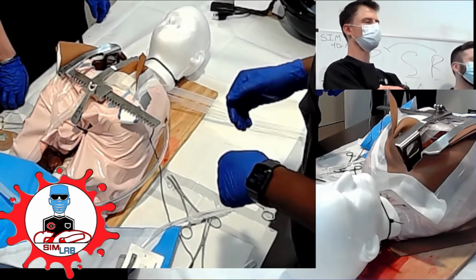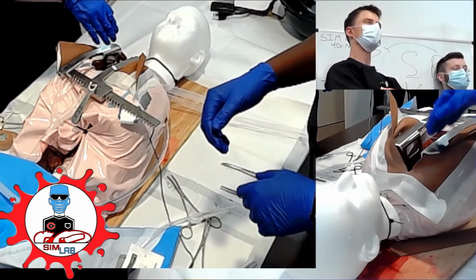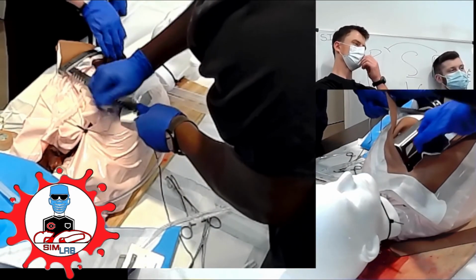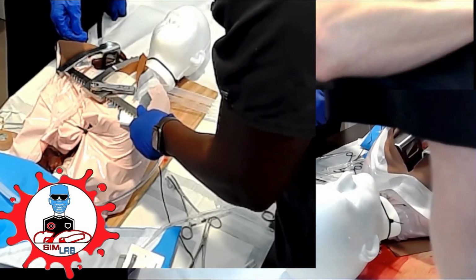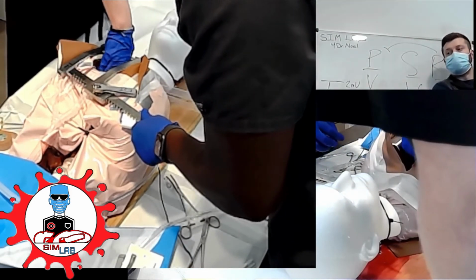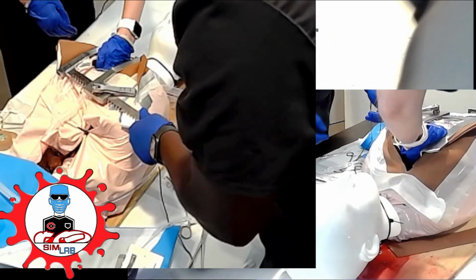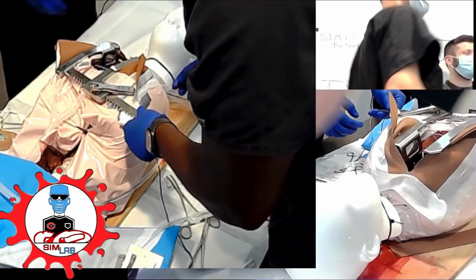And if suction doesn't do it, use the next best thing. Hand? Yeah, so you're grabbing the clots out. Stick them in the black bucket for us. Oh, be careful, there's wires right there. Let me get you another bucket. Very close. Here's the Jello bucket. Scoop it out. Hurry up, patient's dead.